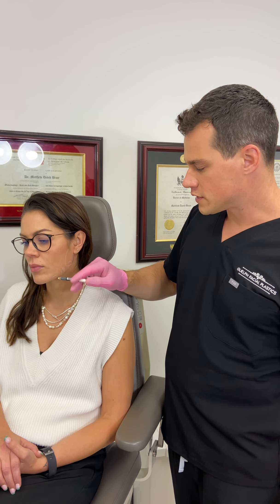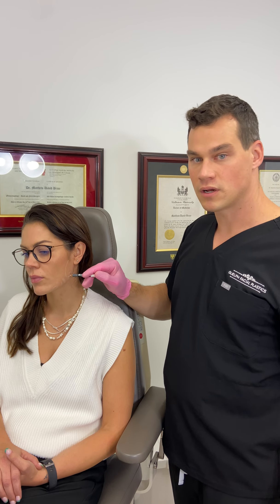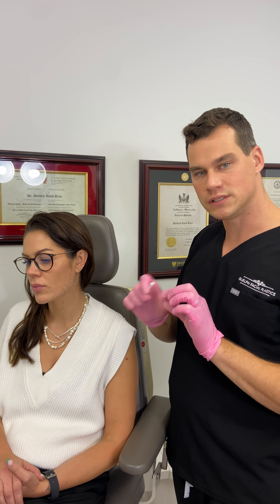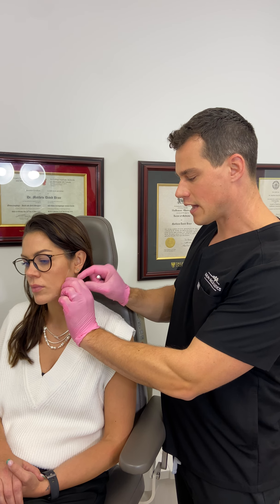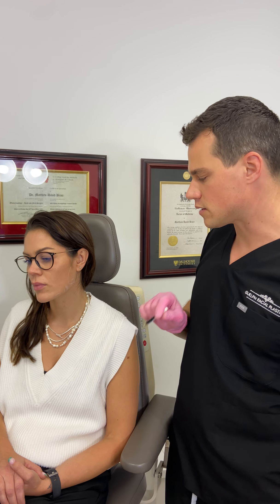For all three of these injections, you want to be deep down onto the bone. They're little depots — little aliquots of filler that you put in — then take the needle out and massage it until you get to the desired end point.